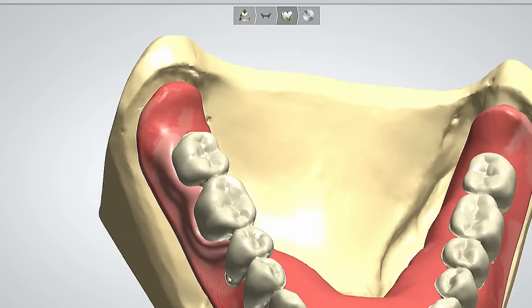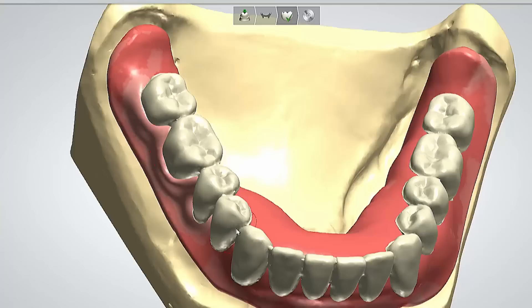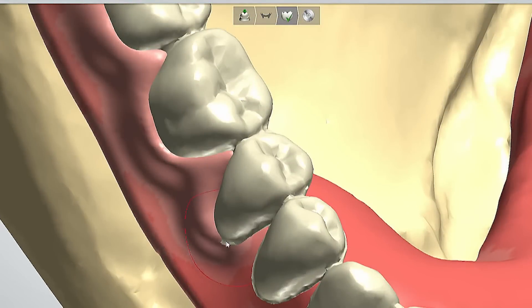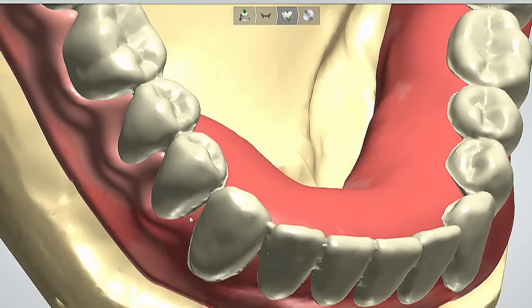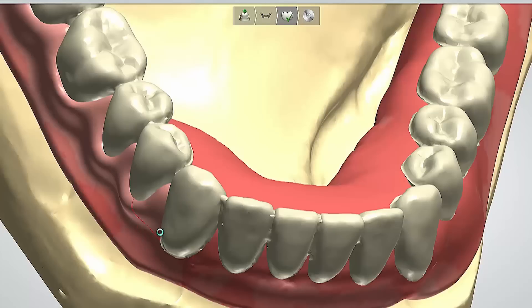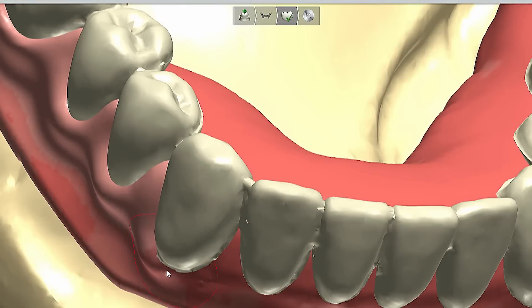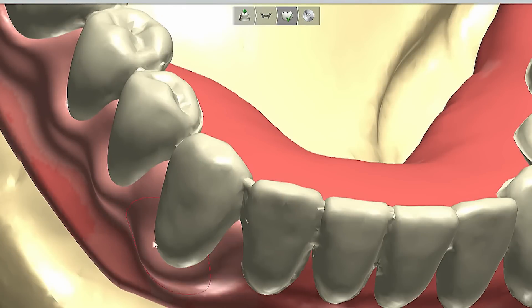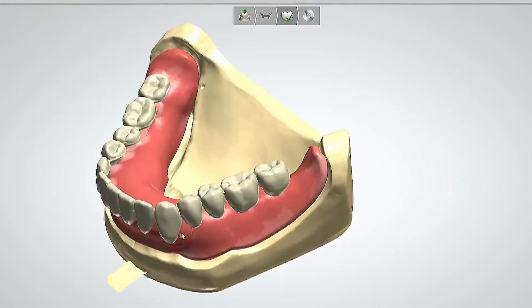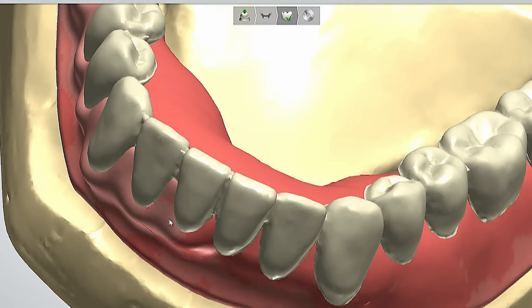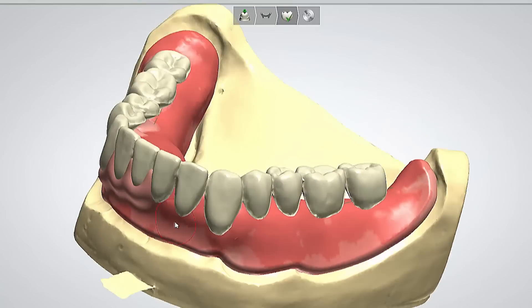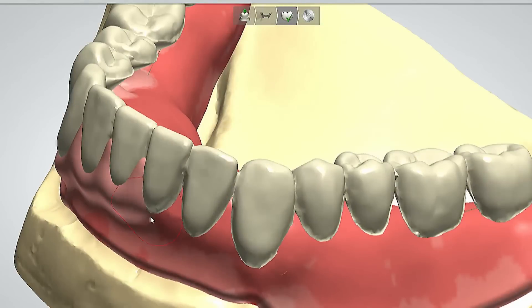You can see that she's festooning — this would literally take me hours to do manually. I actually still like to set my own teeth because I like to have a little bit of control over what I communicate to the technician. Usually what I like to do is set the teeth myself and have the technician replicate that digitally for me. The festooning is done digitally as well.